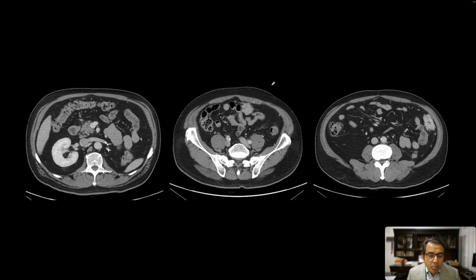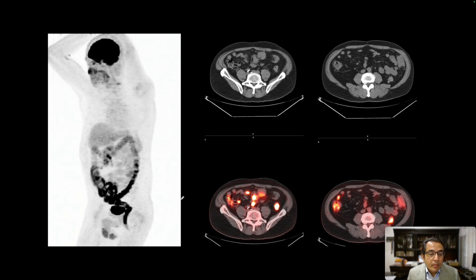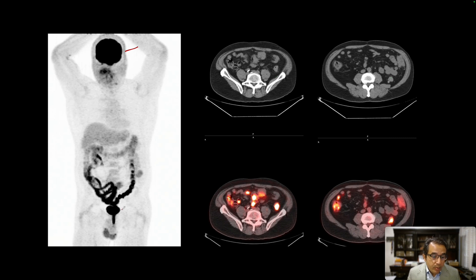Here's our next patient. They were diagnosed with renal cell carcinoma in the left kidney and underwent a left-sided nephrectomy. Follow-up CT images show post-surgical changes and two abnormal enhancing soft tissue density foci in the abdomen and left lower quadrant. FDG PET-CT was then performed. The rotating image shows physiologic intense uptake in the brain, excretion from the kidneys into the urinary bladder, some physiologic large bowel activity, and both tumor foci show increased FDG uptake.